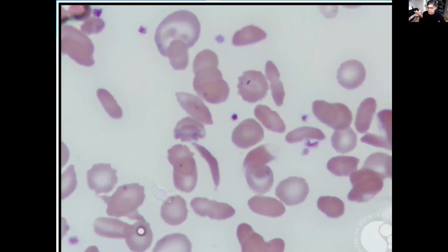Okay, this is a spot the diagnosis moment right there. Who's going to say the answer? The first answer gets a shout out.